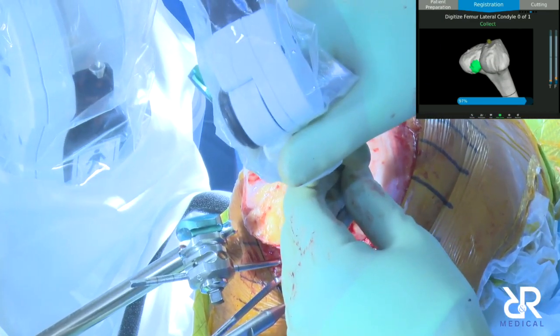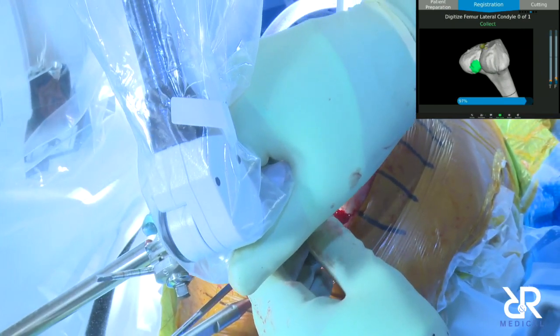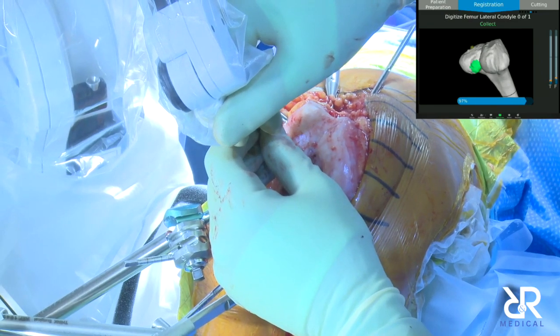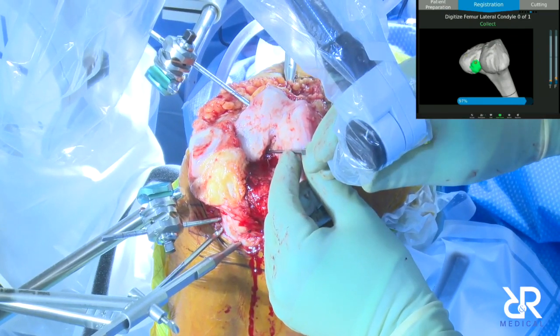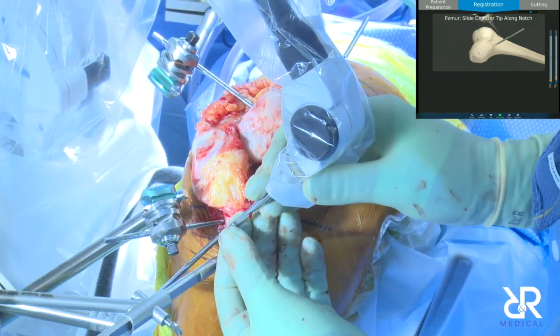Yeah, large deformity. We've done some severe arthritics. We've not done, you know, ones with previous fractures, really obscure stuff. But we've done some real severe arthritics and felt very comfortable with the final result.